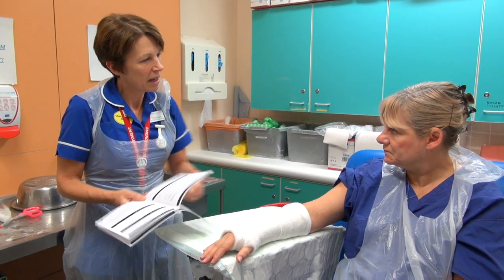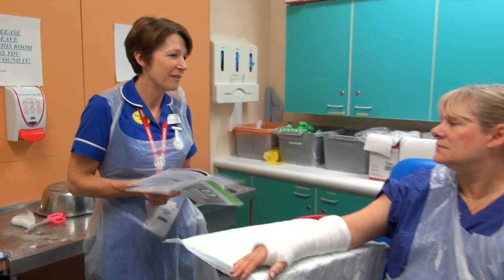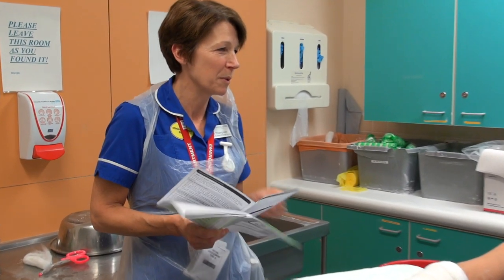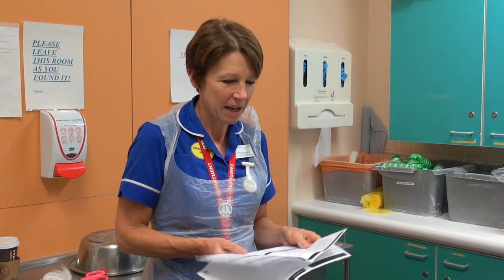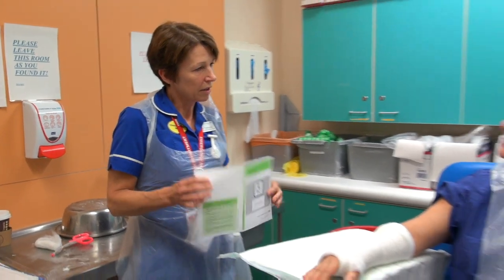Also, don't put anything down inside the cast — no knitting needles. It will sometimes get a bit itchy down there, but just try and resist the temptation to pop something down there, because you may cause further damage or damage your plaster. Any concerns, just contact us.